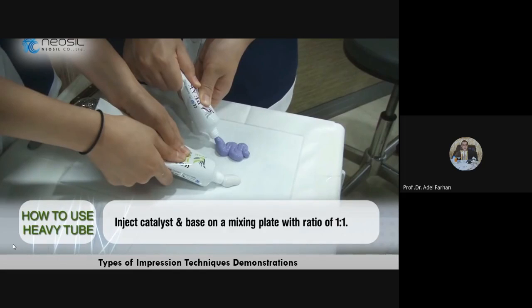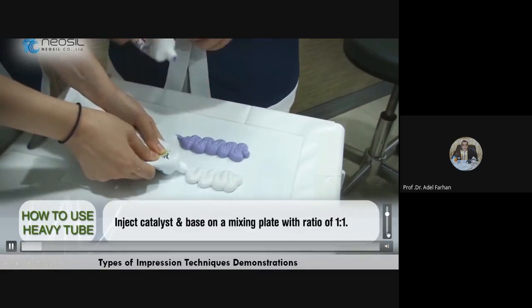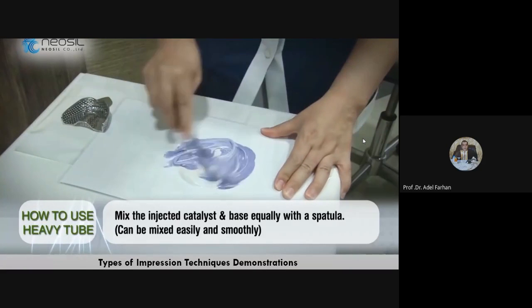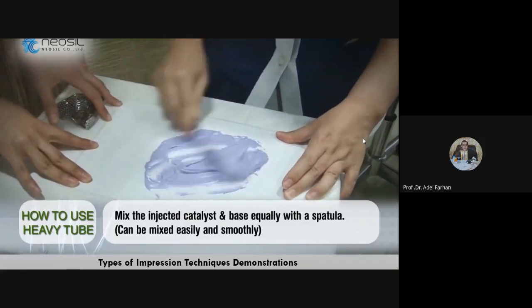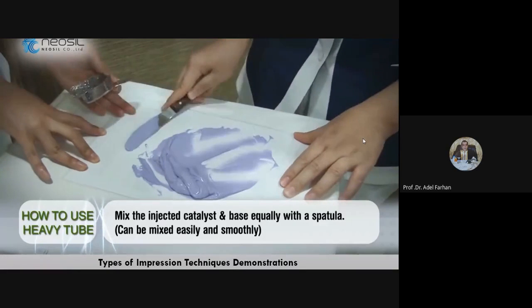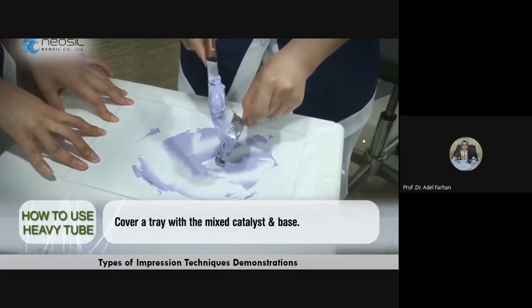طبعا هنا راح نشوف فيلم سريع لطريقة الامبريشن بس حتى تشوفه. اوكي، طبعا هذه الامبريشن تكنيك مثل ما قلنا، هذا يسوي ميكسينج للماتيريال with spatula. طبعا احنا نشوفكم بالسباتشولا لان انتم تستعملون السباتشولا، لذلك يعني نحاول تفهمون كيف عمليا. شوف الميكسينج يكون بشكل حركة دائرية وسريعة، و you are going to load your tray.